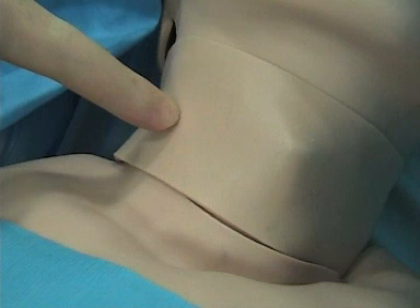Can you use an echo to help you do this line? Yes, you can, and we do encourage it. Here we're going to do it just by using landmarks, but do not hesitate to use the echo to place these lines.